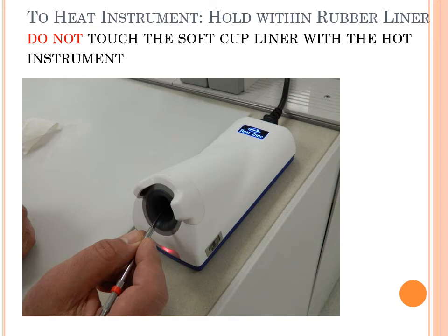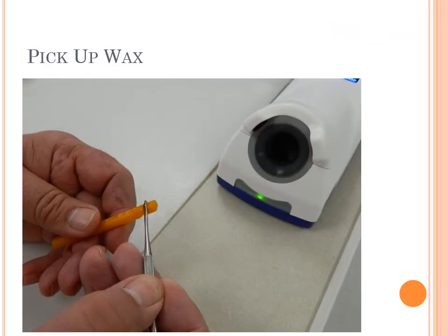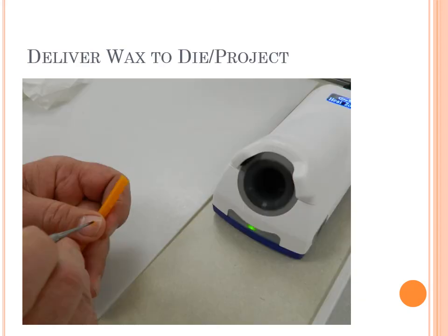Once again, in order to heat your instrument, you will want to hold it within the rubber liner, and you will not want to touch it to the soft cup liner with the hot instrument. You will just be balancing it in the middle. After you've heated up your metal instrument inside of that liner, you will be able to pick up wax because your instrument will be hot. And then you will take that wax that you've picked up and you will deliver it to your project.